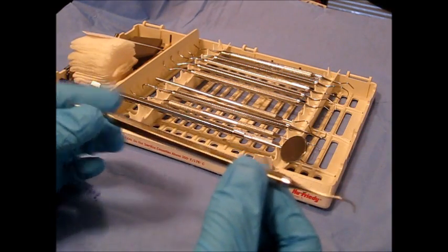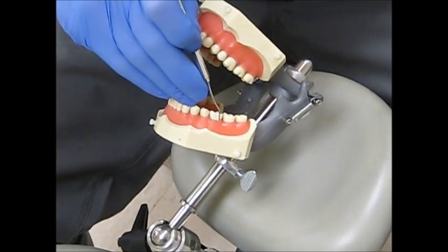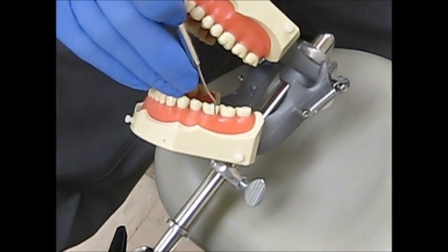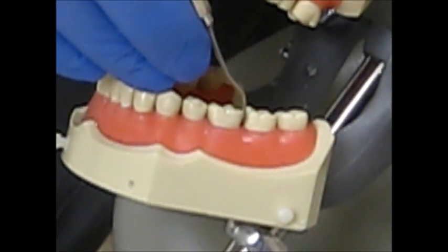Now, let's look at it clinically. For your scaler, you're going to utilize supra-gingival, all surfaces posterior, starting distal line angle to distal interproximal.